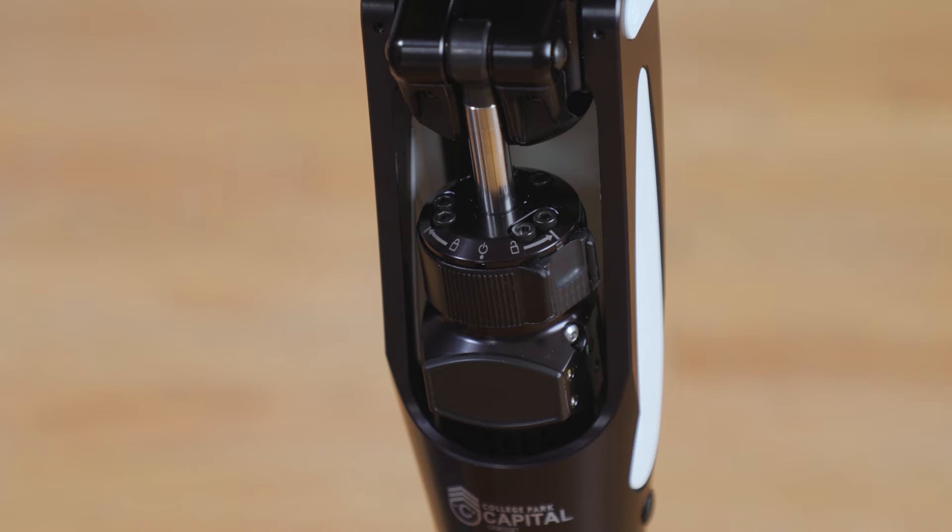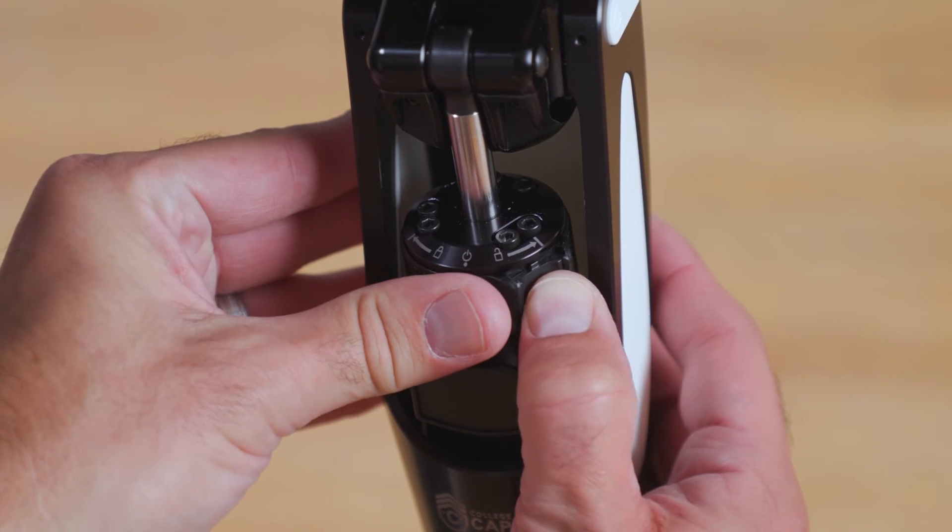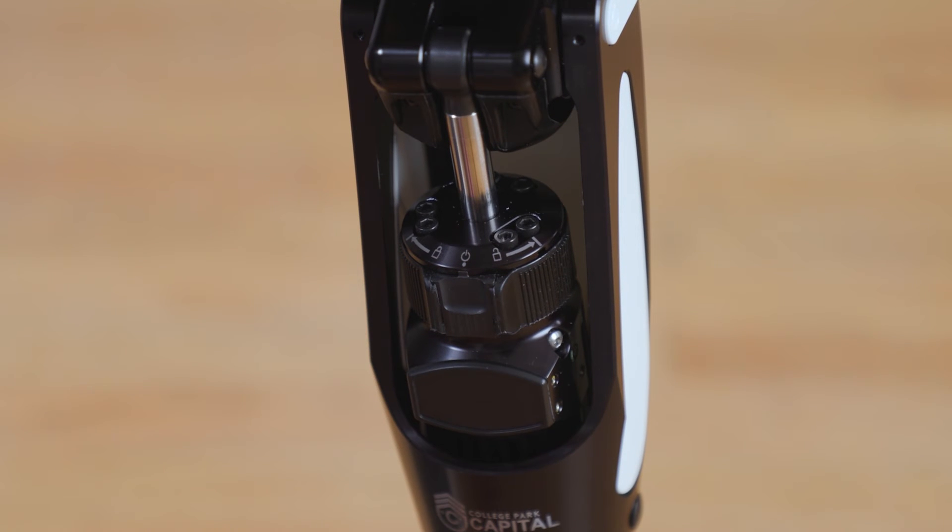Before having the patient ambulate to evaluate dynamic alignment of the prosthesis, ensure that the mode selector switch is in the normal position. This is done by depressing the spring-loaded mechanism in the mode selector switch and placing it in the middle of the range of travel. The spring-loaded tab will engage in the detent in the middle position when properly positioned for normal function.